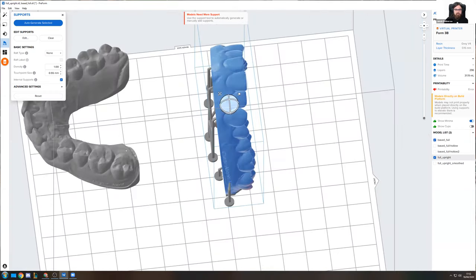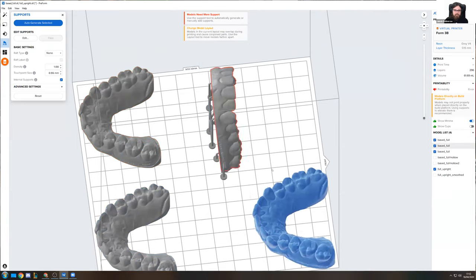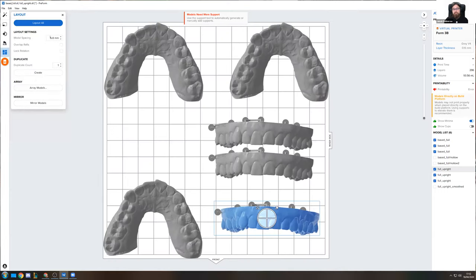And then, if we have all our models prepared, I'm going to duplicate the same model a couple of times to show you a neat little trick that you can also do with the PreForm software. Typically, you would not have the same model over and over again, you would have separate models, but we have this layout function on the left side right here, where you can go in and tell PreForm.